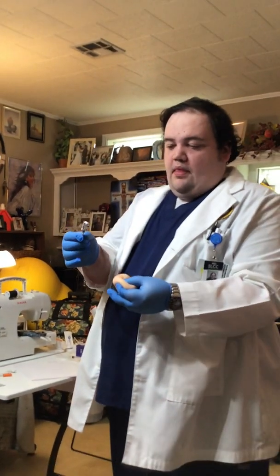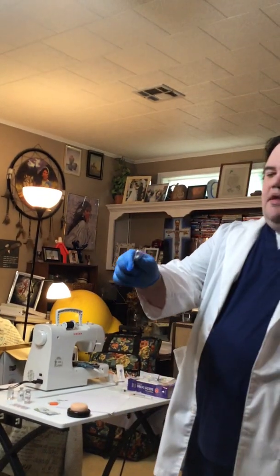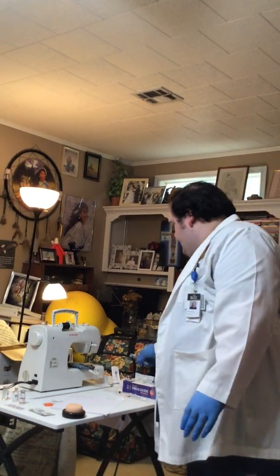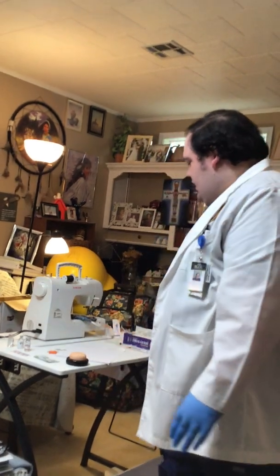We're going in with our non-dominant hand. We're going to take our dominant hand, go in, bevel up, and inject our insulin. There we go. This is a safety needle. We're going to activate the safety device. All right, that's done. That's pretty cool.